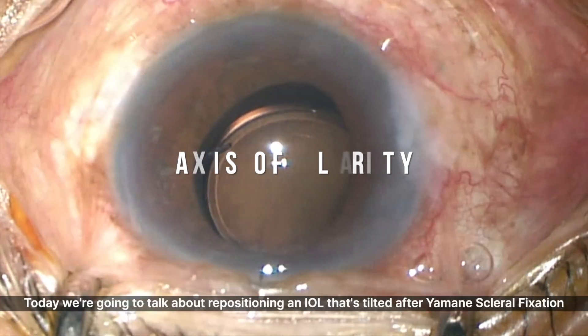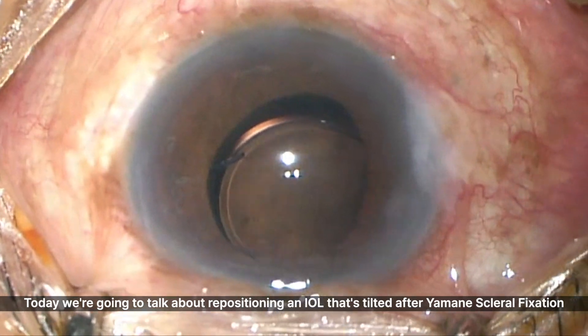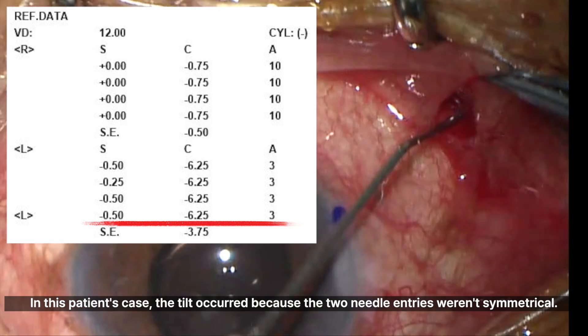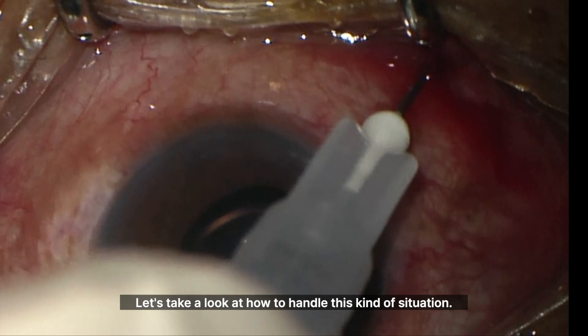Hi, this is Dr. Song. Today we're going to talk about repositioning an IOL that's tilted after Yamini scleral fixation. In this patient's case, the tilt occurred because the two needle entries weren't symmetrical. Let's take a look at how to handle this kind of situation.